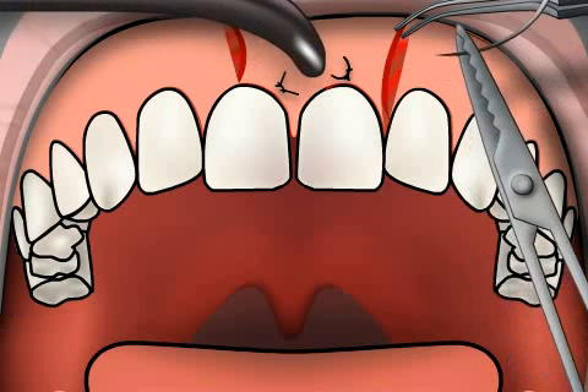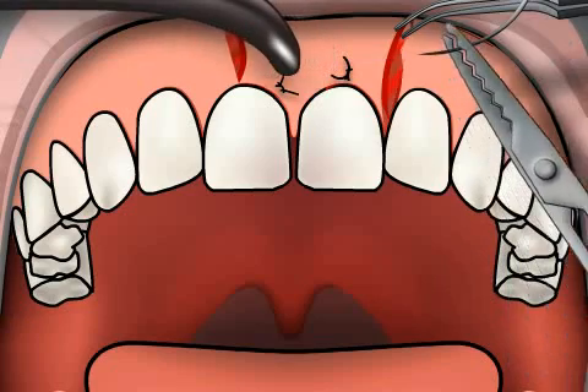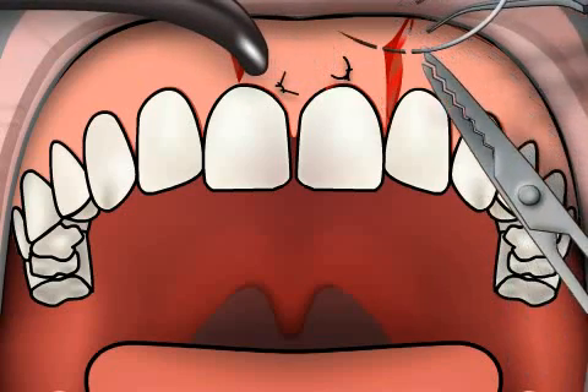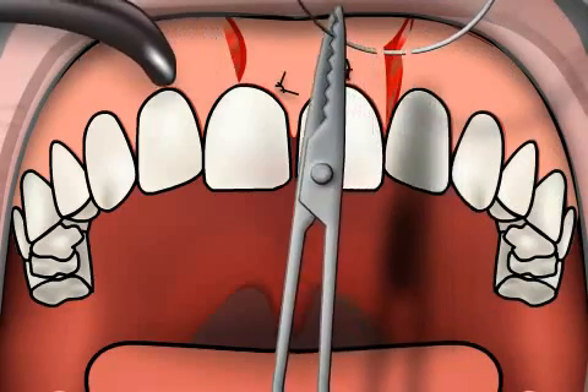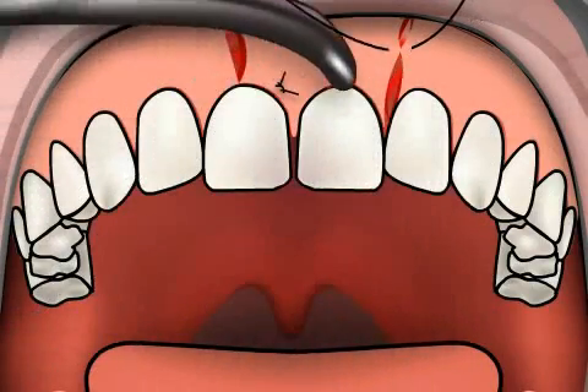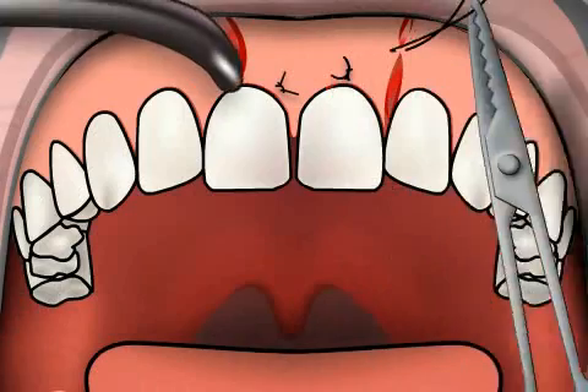Gum stitching is used to close up wounds, for example after mouth surgeries. Stitching up the edges of a wound speeds up the healing process of the wound. Sometimes the stitches burst, especially if they were done too tightly.